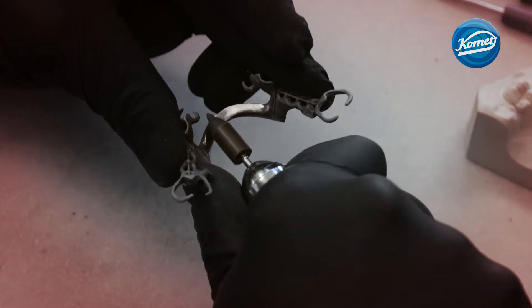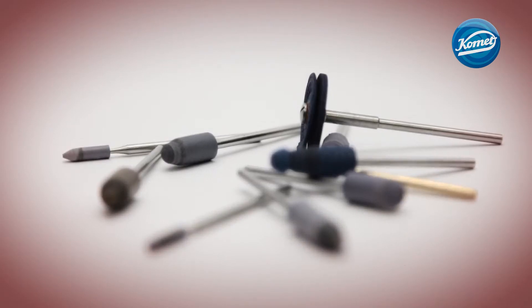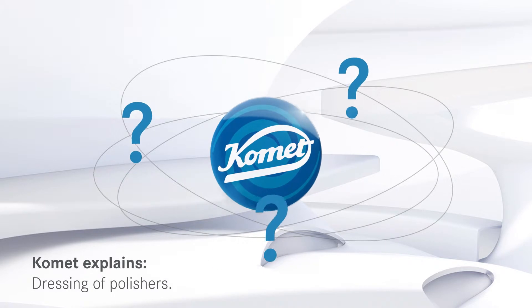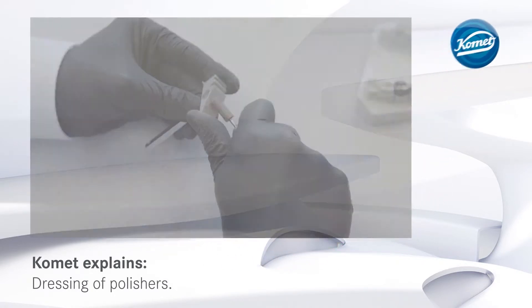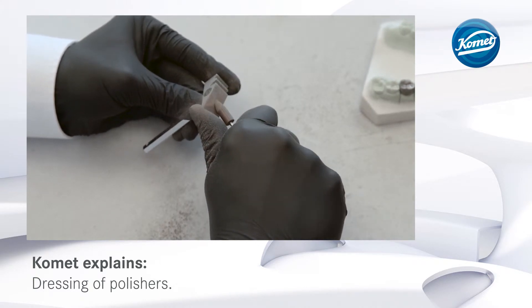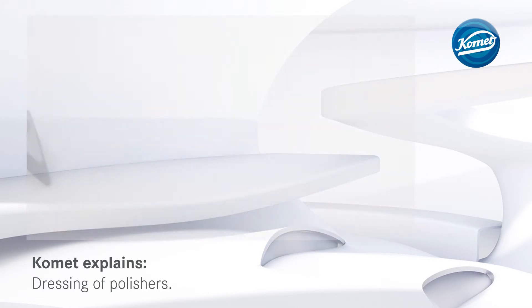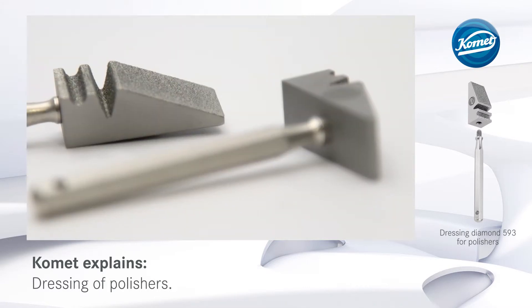Each time they are used, polishers wear down more and more and lose their original shape. To enable the continued use of the polishers and to recreate their original shape, the polishers can be reshaped on Komet's Dressing Diamond 593.